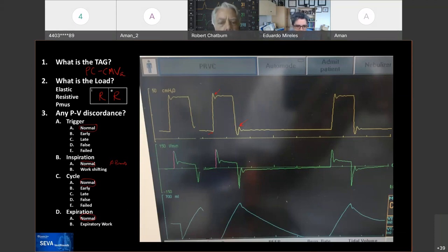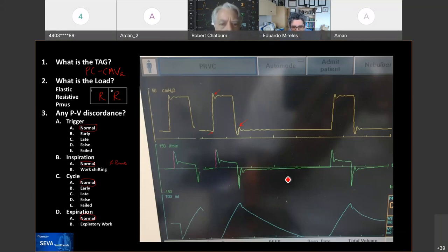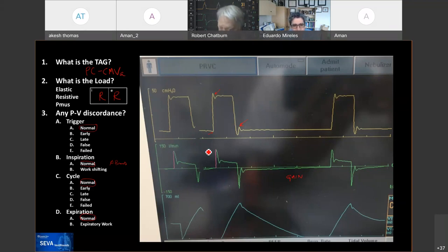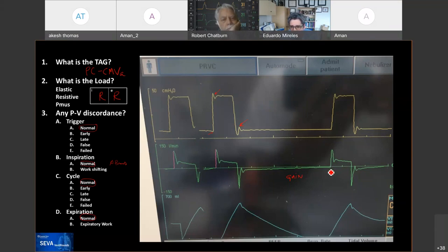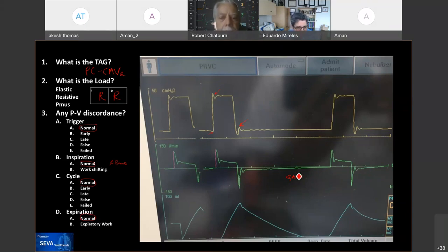Does this patient have auto-PEEP? It's possible, but probably not because the flow does look like it's coming back to baseline — though we may have to zoom in. It feels a little bit high. Doing an expiratory hold to confirm would be the right move. A common error: most ventilators auto-adjust the gain on their waveform display. This is scaled all the way to 150 liters, making it really hard to see the difference between waveforms. The only way to unmask that is either an end-expiratory pause or a gain change.